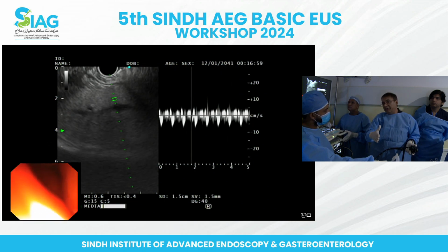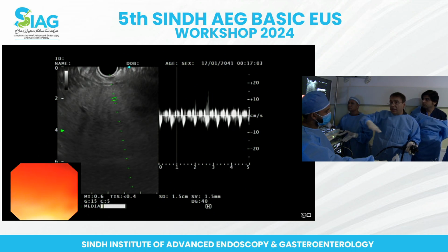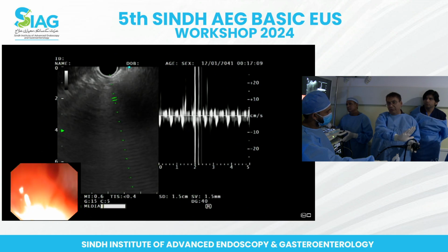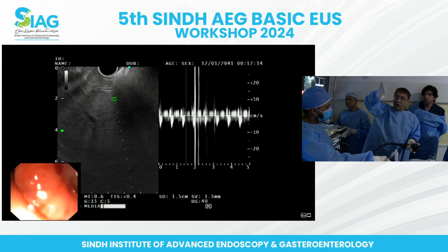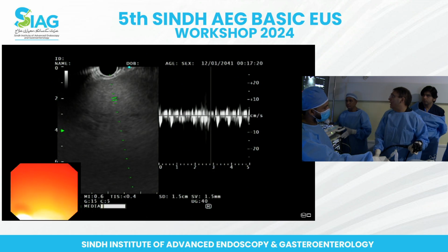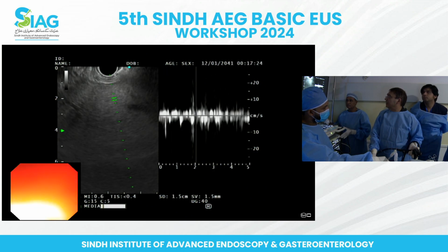If you have to put a stent for the hepatogastrostomy, segment 3 is a little bit downwards towards the cardia and a little further towards the proximal body, and if you put a stent in there, it faces downward, so the bile flow goes downwards into the stomach. So these are a few things you can keep in mind when doing these interventional liver drainages.